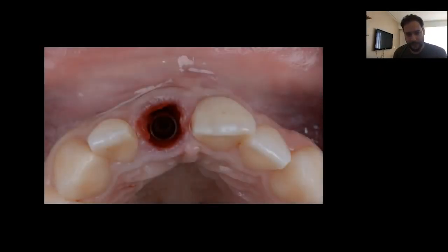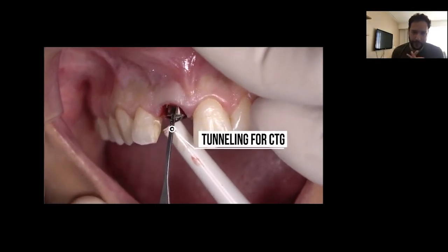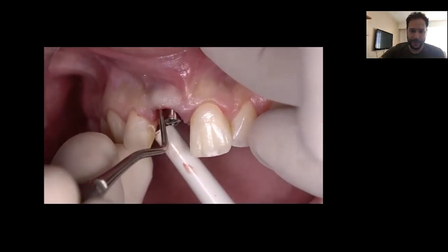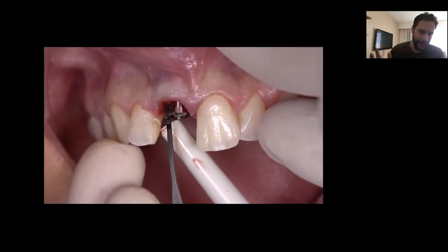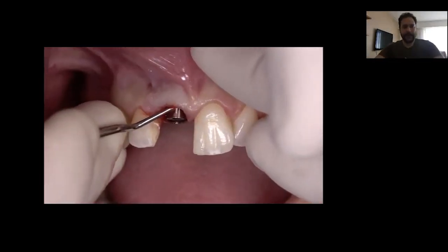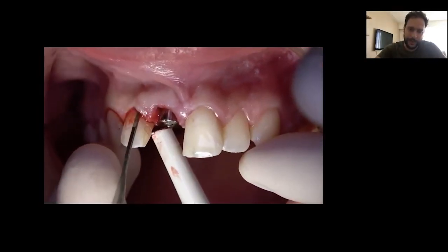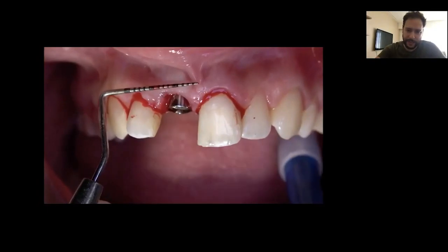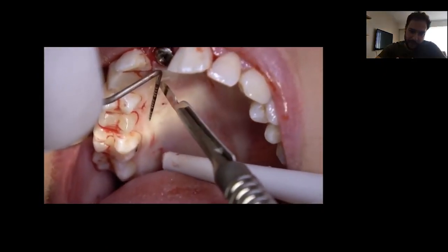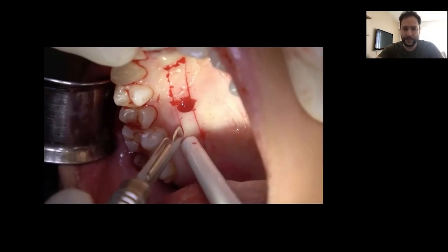Achieving the correct 3D positioning after surgery was really easy, without any effort or stress. I can now focus on the mucogingival procedures that are needed, as we know this contour is going to be lost if we don't act. We are creating a tunnel and a pocket so we can augment with soft tissue and avoid the horizontal resorption that occurs after tooth extraction. We then go to harvest connective tissue — we are also covering recessions on the upper right side, so we are harvesting soft tissue for both situations at the same time.